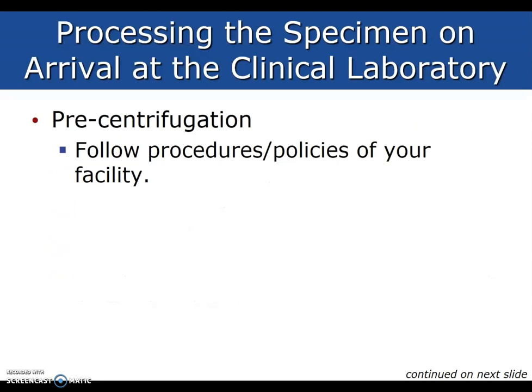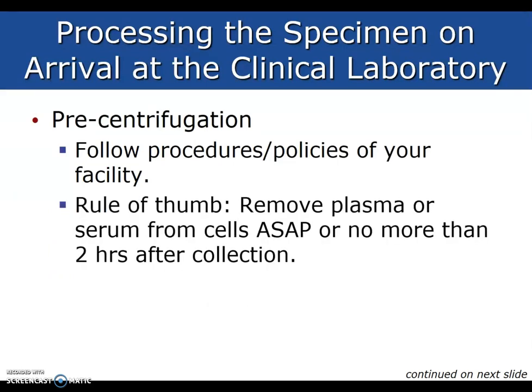Pre-centrifugation, we're going to follow the procedure policy for your facility. Rule of thumb, remove plasma or serum from cells as soon as possible, or no more than 2 hours after collection.